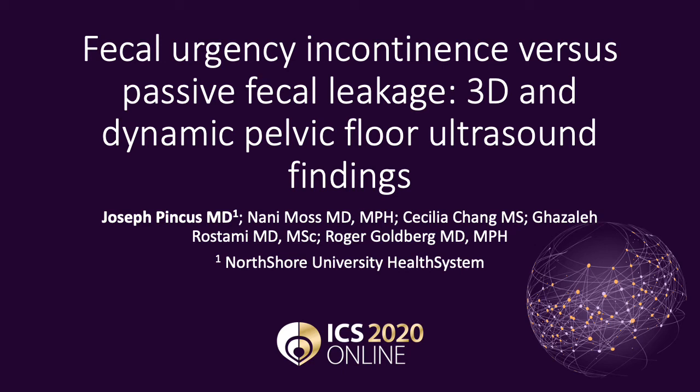My name is Joseph Pincus, and I'll be presenting our work on fecal urgency incontinence versus passive fecal leakage, 3D and dynamic pelvic floor ultrasound findings.